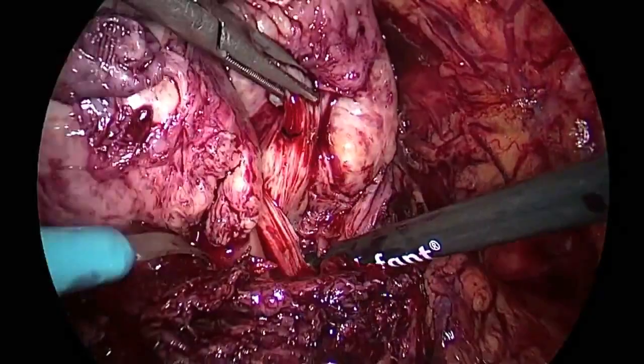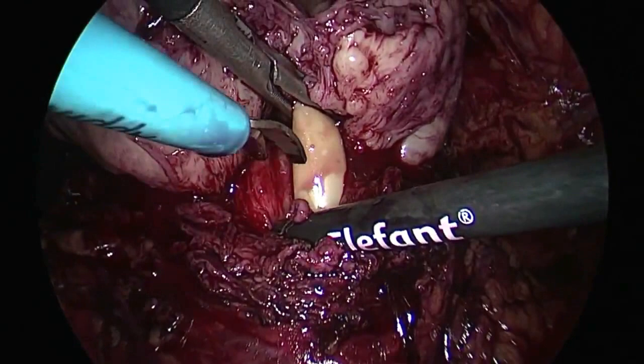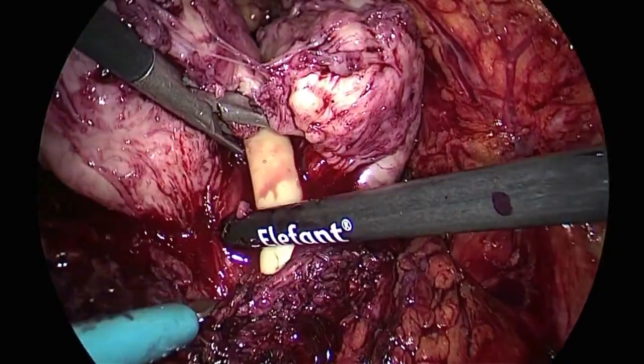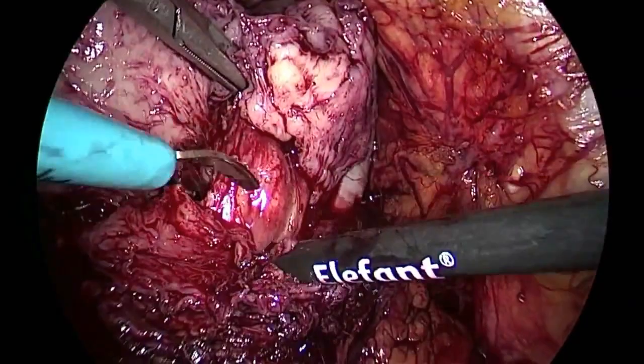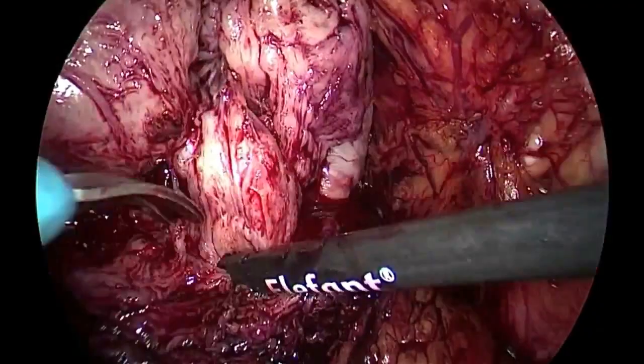So if we have the median lobe, you can perform the incision here at the level of the mucosa. You can perform the enucleation of the median lobe without difficulties, like we do during radical prostatectomy. You can remove a little bit, okay? Now you can see there is a small median lobe. Okay, it's clear. Perfect.